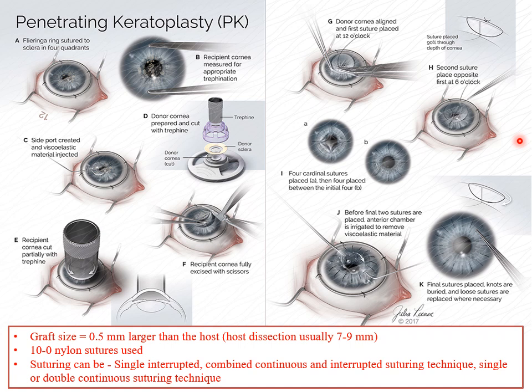You cannot make it very tight. You cannot make it very loose. And then you place the subsequent sutures. So 4 cardinal sutures. The subsequent sutures are placed at 9 and 3 o'clock respectively. I hope you have understood. And then sutures are placed diagonally in between the 4 cardinal sutures.